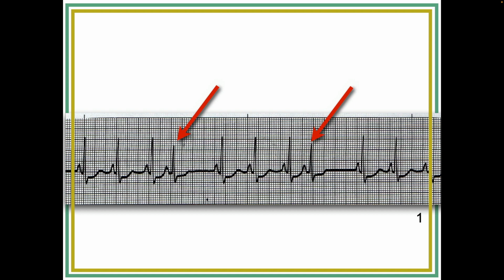Yes, please. I'm just curious as to why the amplitude on those premature beats is smaller than the ones that are part of the regular phase. Well, they are not always, but in this particular case, and in a while you'll know why I'm saying that. Let's see, why would they be? I thought I had the answer, now I'm thinking. So this is an atrial premature beat. The ectopic focus is in the atria, and you'll learn about that pretty quickly. Let me get back with you. I think I know the answer, but I'm not entirely sure.